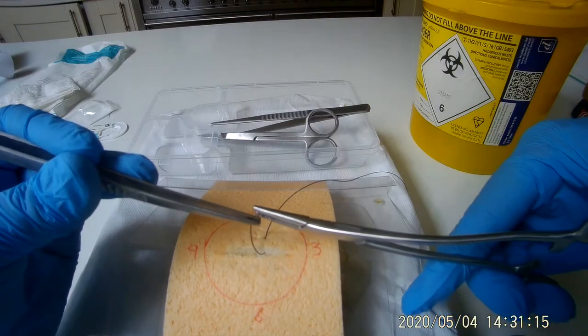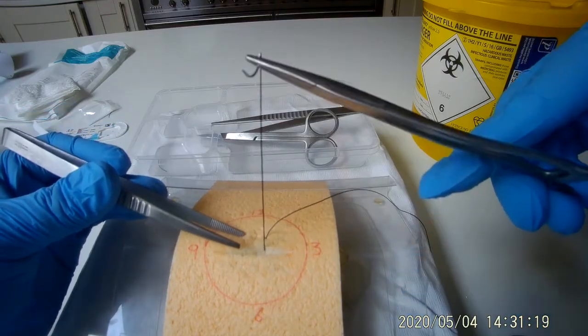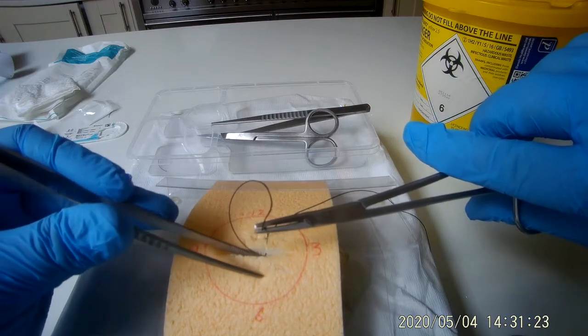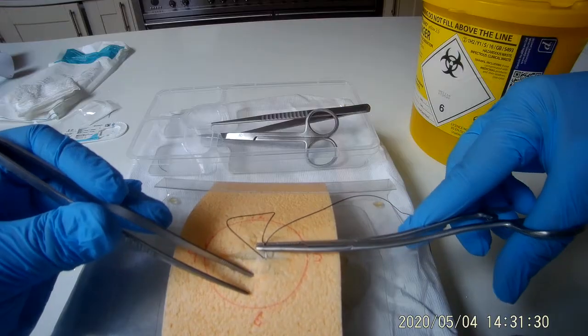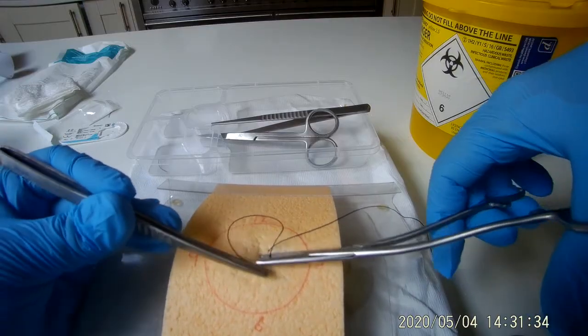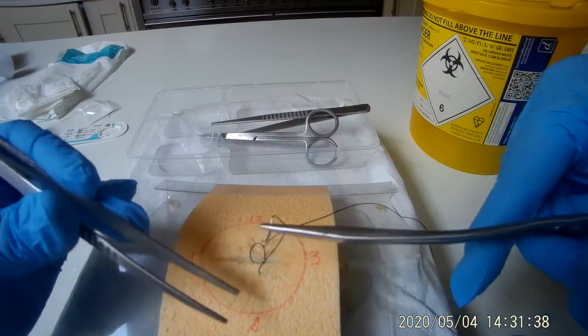Re-grasp the needle with the needle holders as soon as possible. Grasp the wound edge that is nearest to you and bring the needle back inside the wound. Rotate your wrist to bring the needle through the skin, approximately half a centimetre away from the wound edge that is nearest to you. Now grasp the needle with the non-toothed forceps to pull it through and re-grasp with the needle holders.